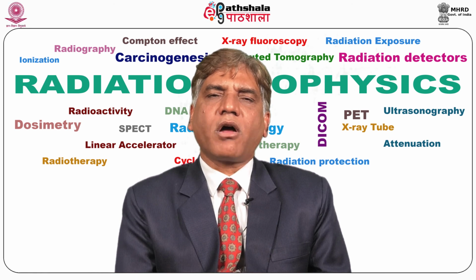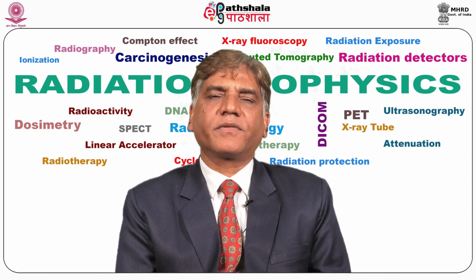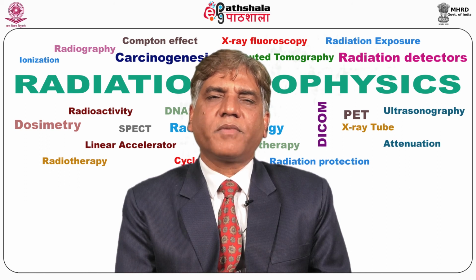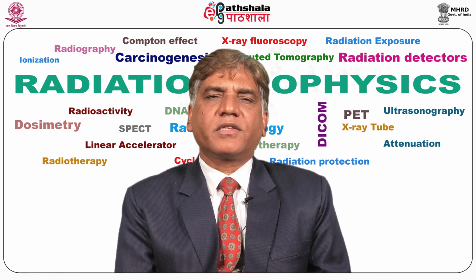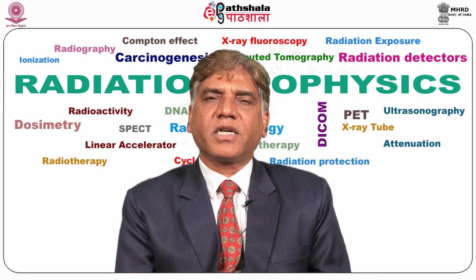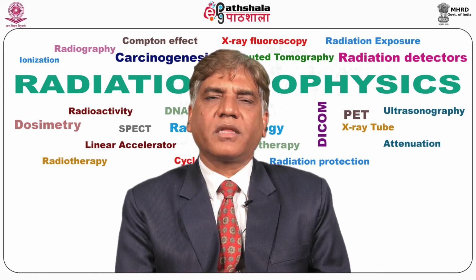The last part is the radiology information system, known as RIS. In modern digital radiology, the RIS forms the backbone of the department, which controls almost all aspects of radiology workflow. The RIS drives the workflow and transfer of information across the department. It deals with non-image text-based computer functions such as scheduling of appointments and generation of bills and reports.